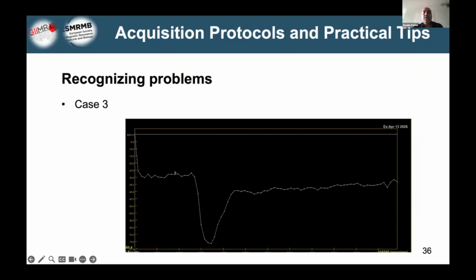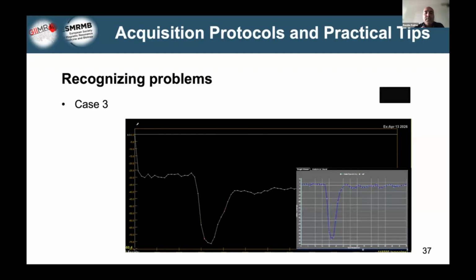And in this case, we have a signal decay curve that demonstrates a less pronounced curve, more rounded peak, resulting from a bolus of 2 milliliters per second. And here is the balance of what we are looking for, a more narrow peak.